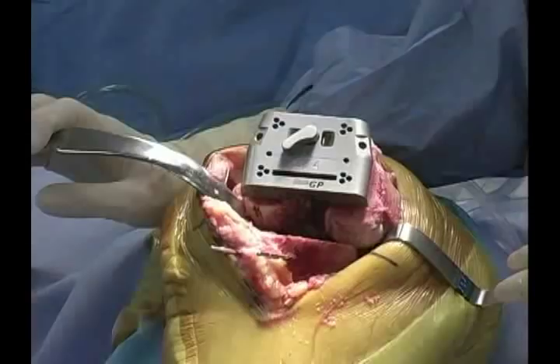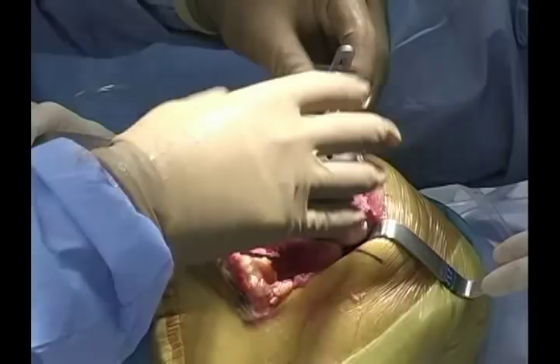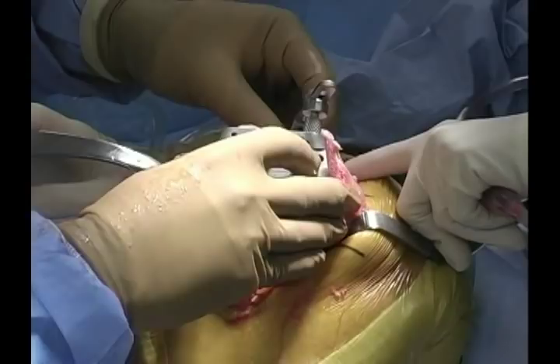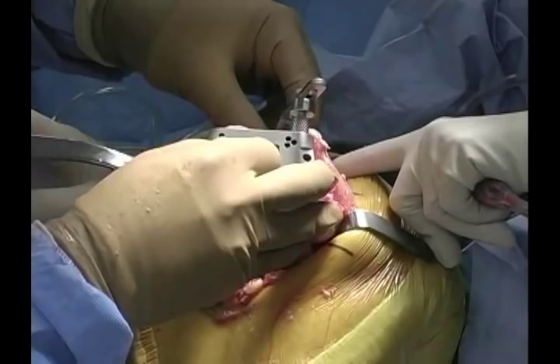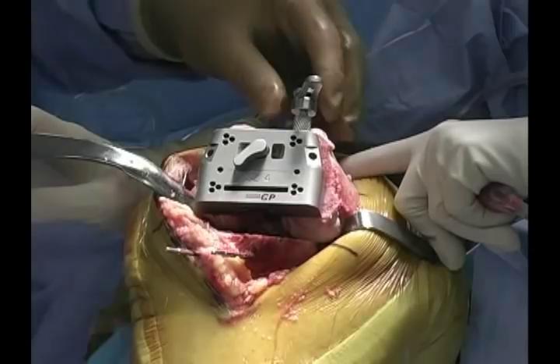We have a stylus that goes on the front of the block and locks in place. This stylus is essentially an anterior referencing system that allows you to translate down from the anterior cortex of the femur and provides a starting point for balancing. The block is then translated posteriorly based upon that and locked in place — it's free to rotate, and the rod is free to rotate.